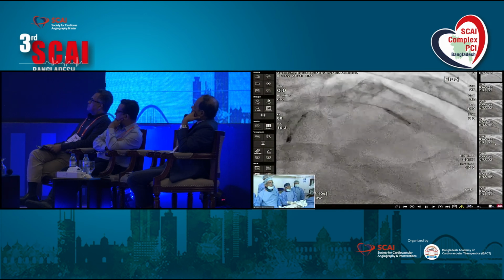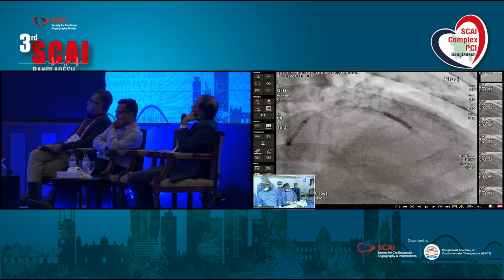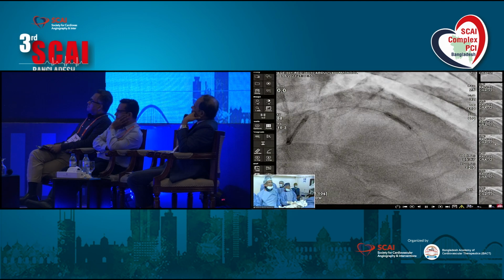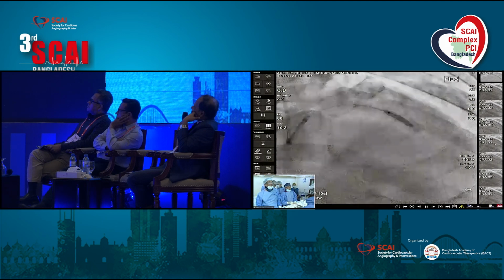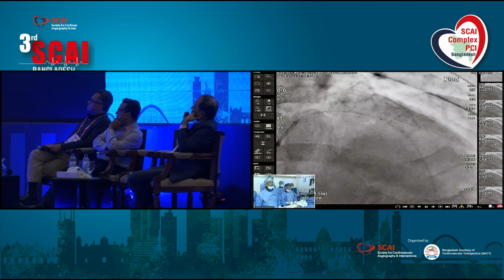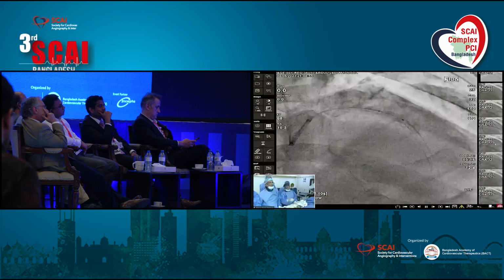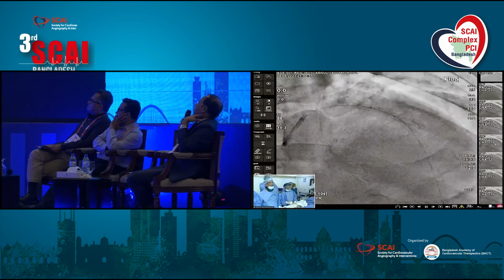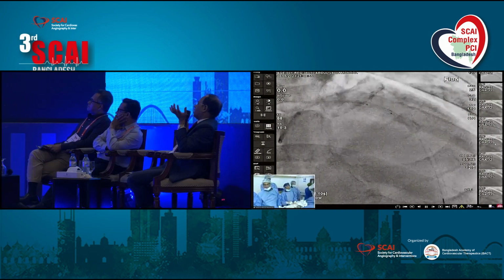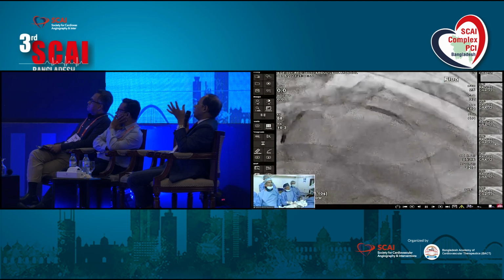Yeah, so the OCT data on the malapposition and 300 also, we don't have outcomes based on that. We know we do more aggressive ballooning if it is more than 300, but what does it exactly mean? To give 3.5. So, this is NC balloon, yeah? Yes. The recommendation is 12 atmosphere is the nominal for NC.